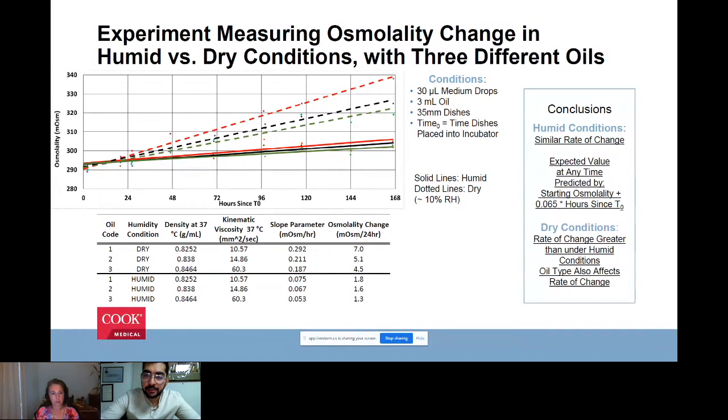Another one here says, what is better: do you make culture dishes a day before, or make culture dishes half an hour prior using pre-equilibrated media? If you use pre-equilibrated media, you have to think about that in your own lab. Do you really have the time to make dishes in a controlled way? So making sure you don't do more than 1 to 2 dishes at a time. If you're using pre-equilibrated medium, of course you could do that if you wanted to, but you need to figure out what your patient load is. Yeah, you could rush things.